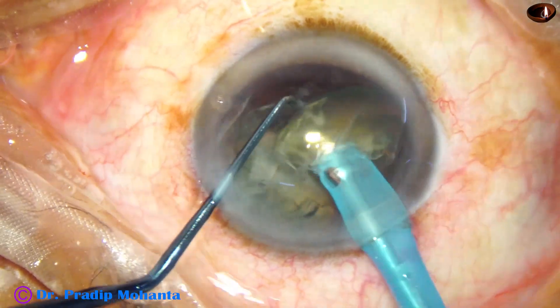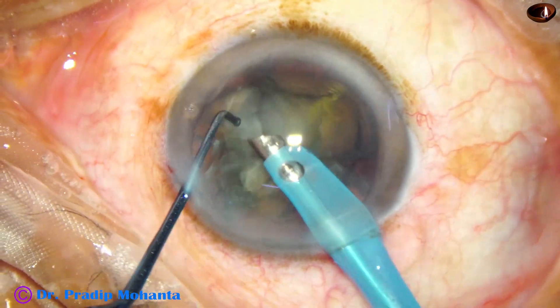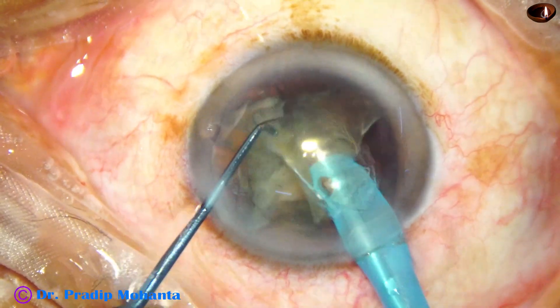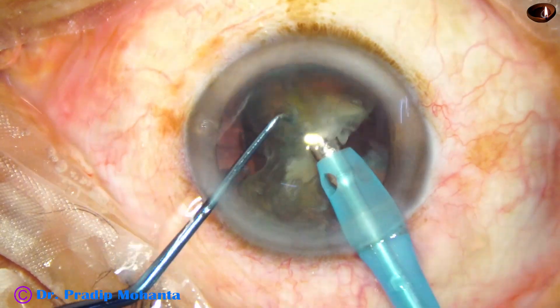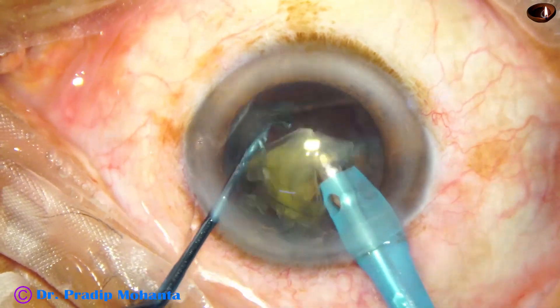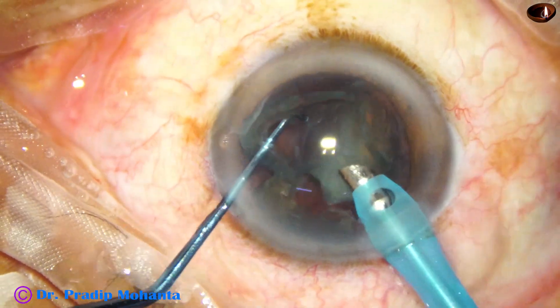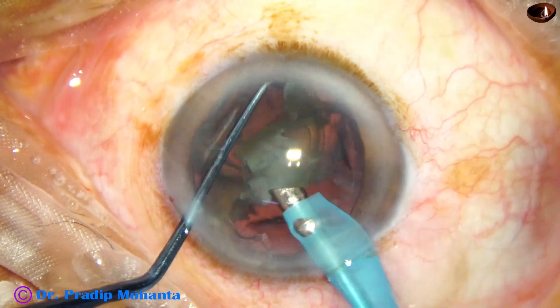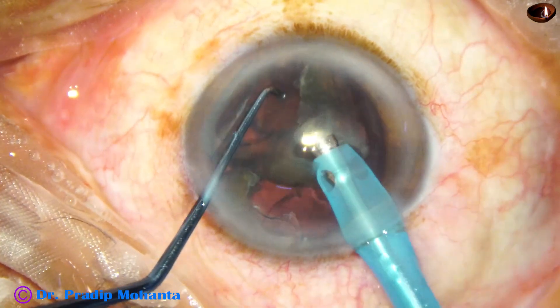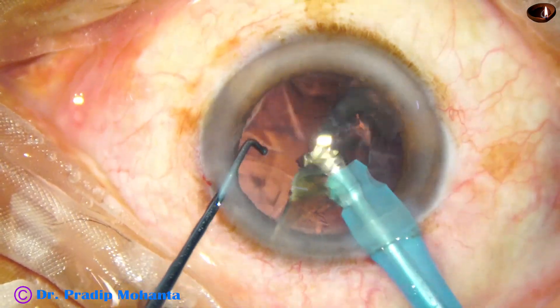Now go with the handpiece and see how quickly we can grab each nuclear piece and emulsify. This is the second nuclear fragment. We don't have to go to the periphery or chase the nuclear pieces — we just hold the apex of each nuclear fragment and emulsify, remaining in the central safe zone of the anterior chamber.